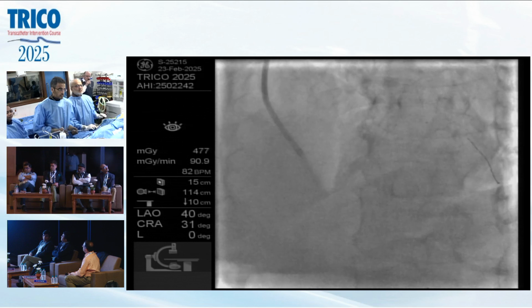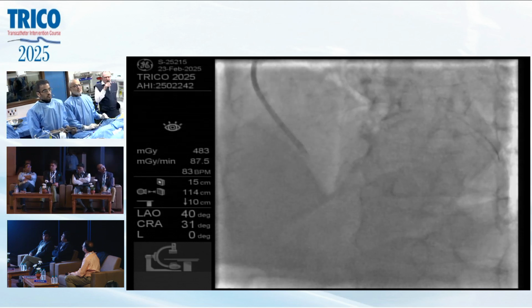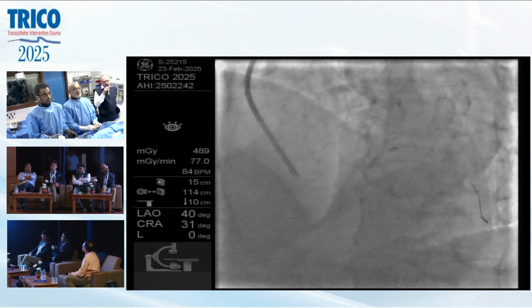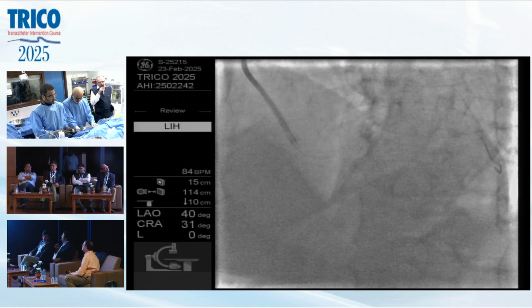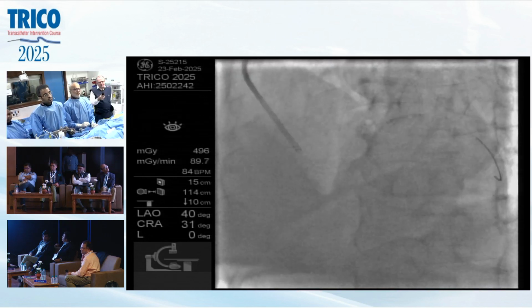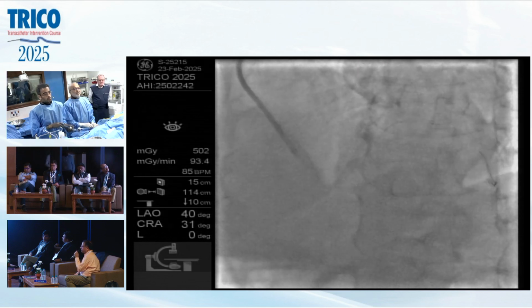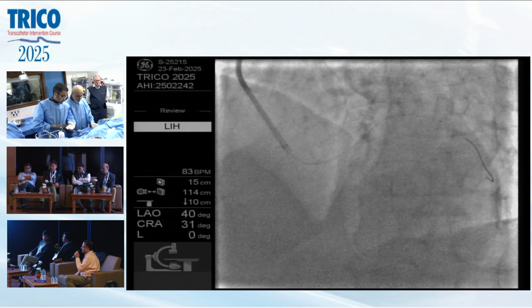8, 10. Samir, whilst they're doing this, do you want to maybe just ask the panel what their favorite approach is to dealing with these anomalous circs, particularly in terms of guide catheter choice, wires, 2 wires, guide extensions. Any comment, guys? If you want to say one by one, what is your choice of guide catheter? Dr. Lakshman Das, please, if you want to start.